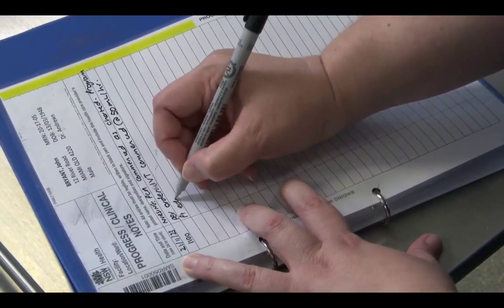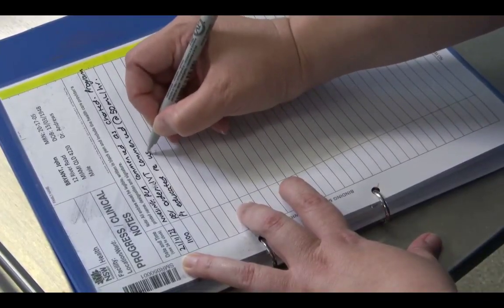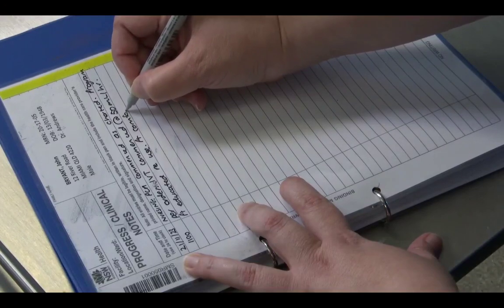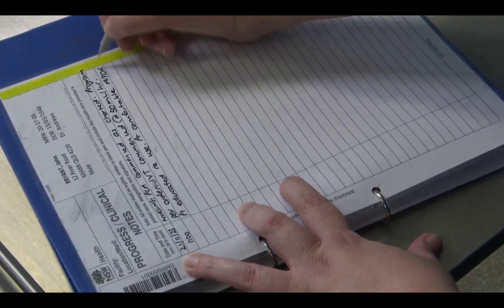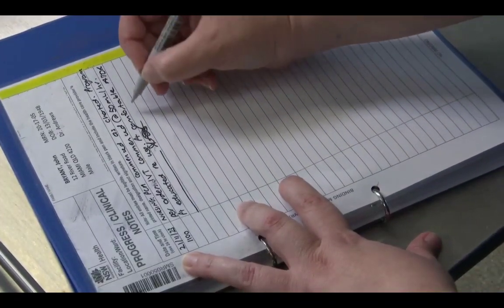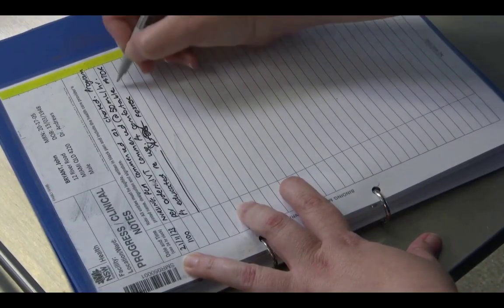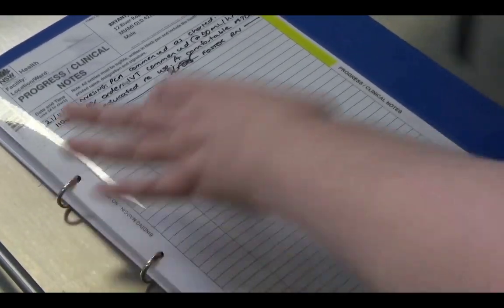patient educated, reuse, patient comfortable at time of report. My name printed, and my designation as RN. And that's it. We're complete.